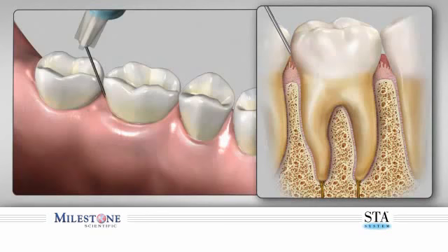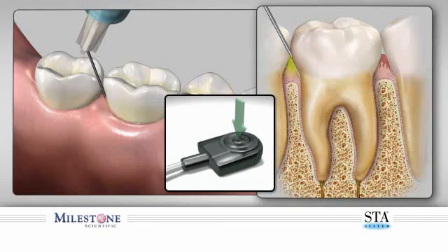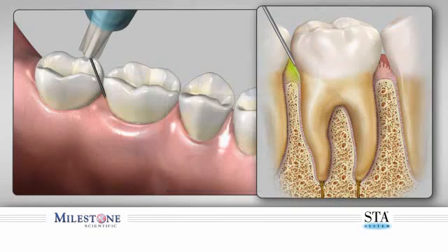While holding the handpiece with a pen-like grasp, approach the tooth at about 45 degrees with a bevel towards the tooth. Place the needle very slowly into the gingival sulcus as if it was a periodontal probe, while simultaneously initiating the control flow rate. The control flow rate is initiated by depressing the foot control, and after 3 audible beeps, you will hear the unit announce cruise.